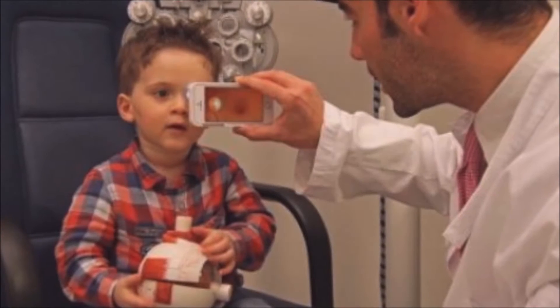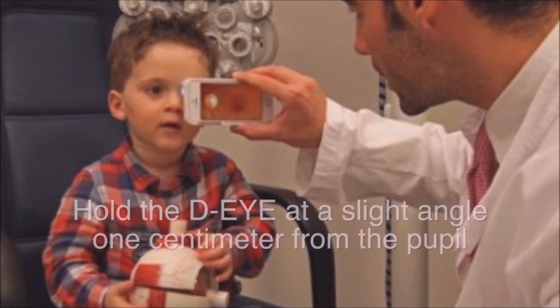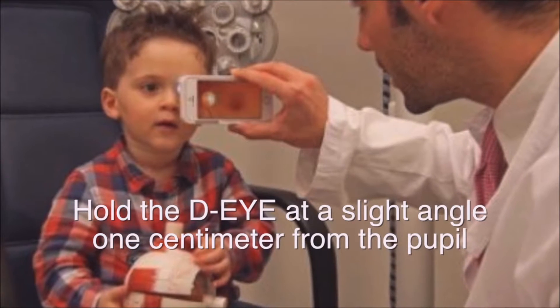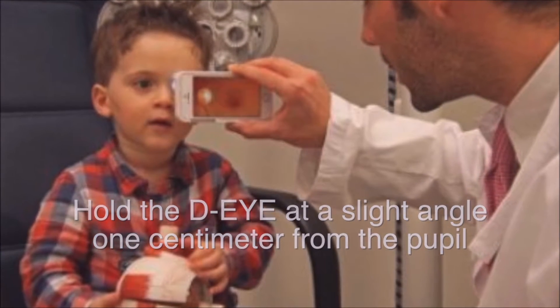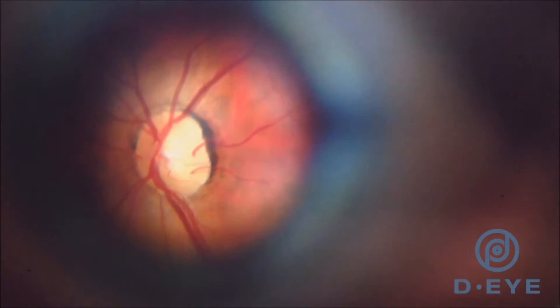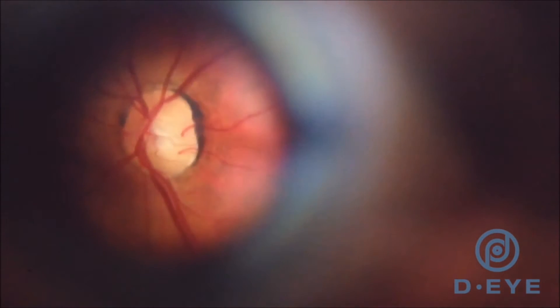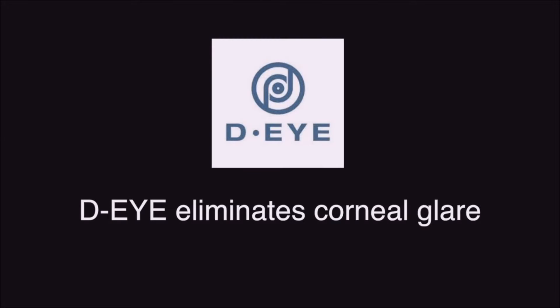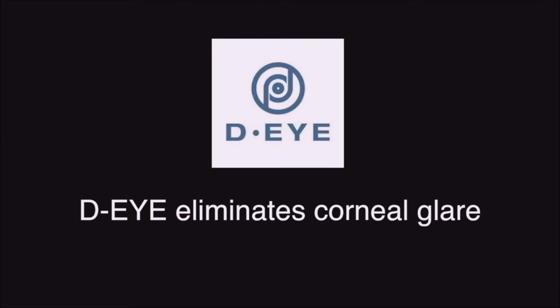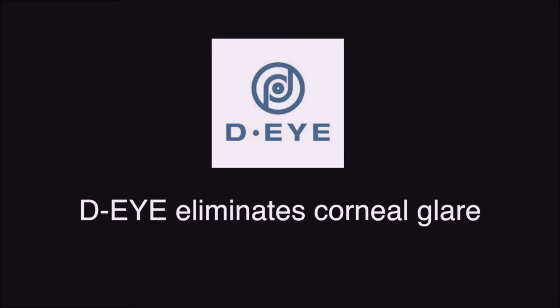If you are well practiced using an ophthalmoscope, the DI works the same way. You must get as close as you can to the pupil at a slight angle so you can see the red glow from the reflection of the fundus and find the optic disc. The good news is that the DI lens eliminates corneal glare, so it should be easier to capture good scans of the posterior pole of the eye.